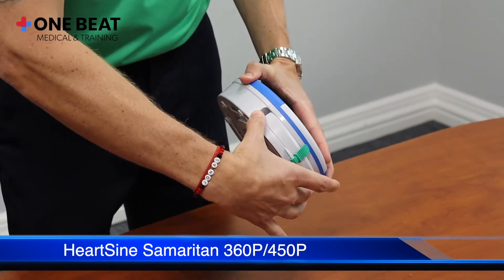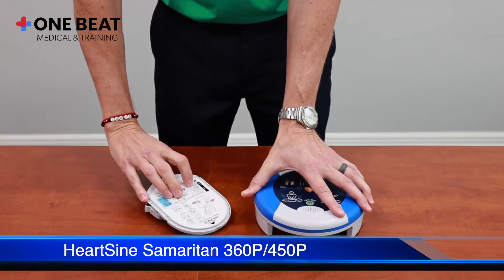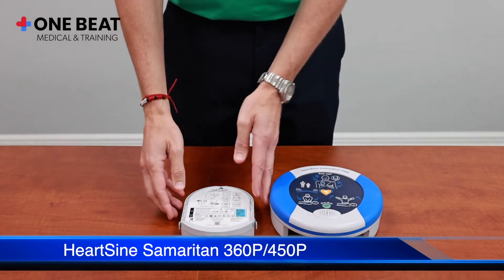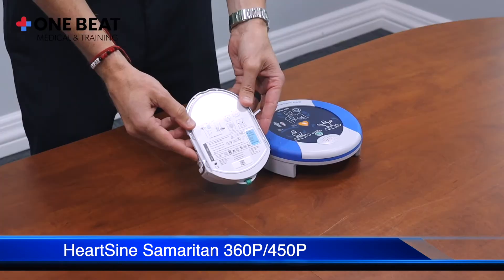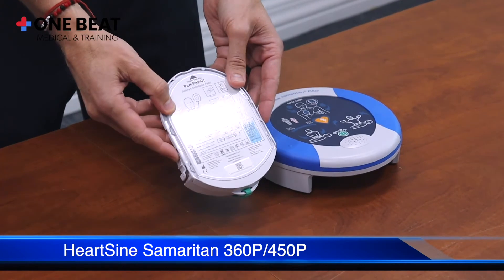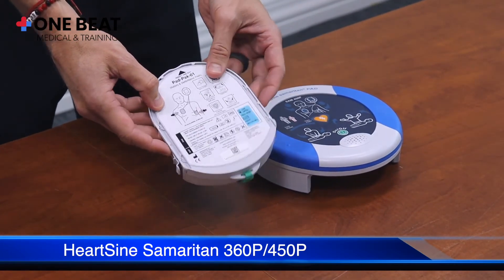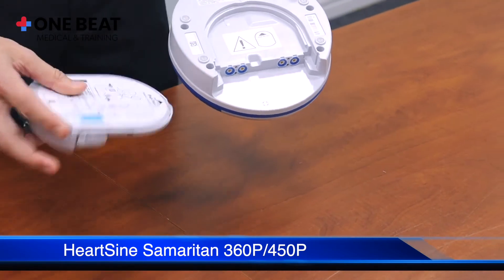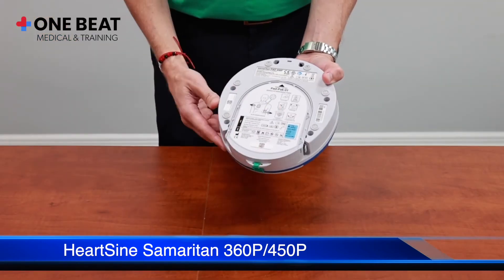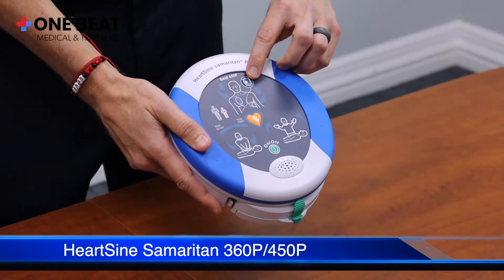The pediatric pads show placement on the front and back. When switching out the pads, you pinch here to remove the pad cartridge. The pads and battery are both located inside, so you have pads and battery in one combo pad pack. To insert it into the device, it clicks into place and the light will begin to blink.